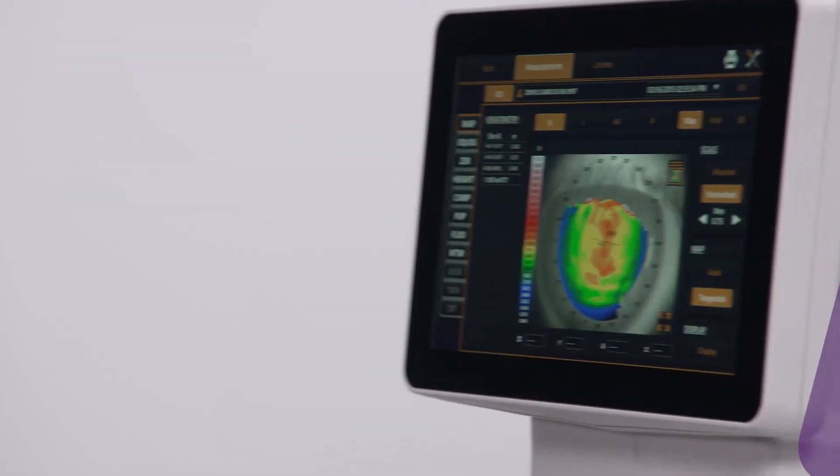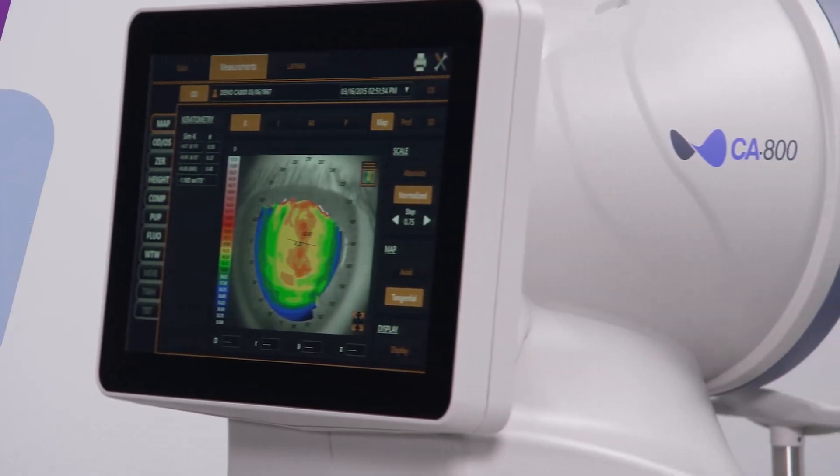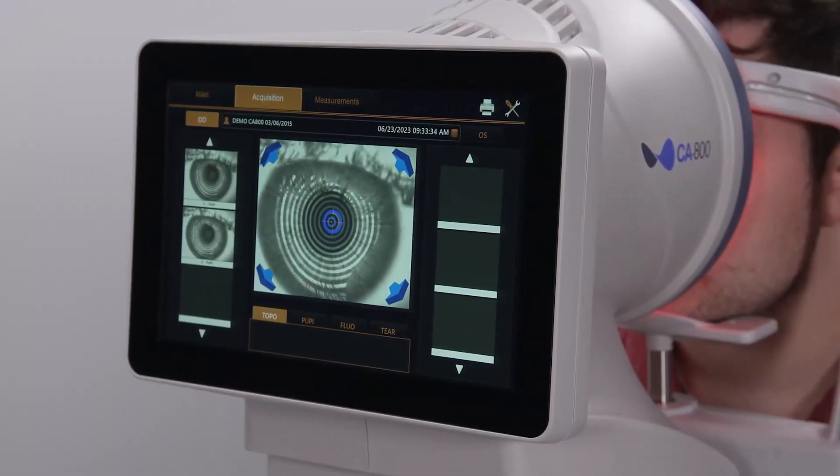Hi, I'm Candice, global trainer for TopCon Healthcare. Mapping the cornea with the CA800 is quick and easy, with visual guides to ensure the device is positioned correctly.